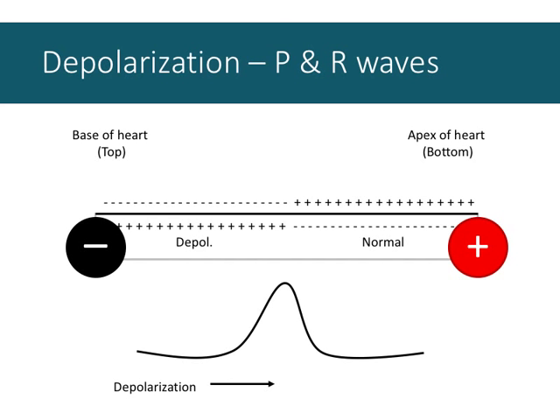So I have my two nodes that help read the signal as it moves through space or moves between them. Depolarization is the act of making the cell more positive. As many subsequent cells become more positive, that is a positive wave of depolarization. As it moves towards the positive electrode, we get an upwards deflection. This is characteristic of depolarization of any cardiac cell, or the atria and the ventricles as we think about them at the organ level.